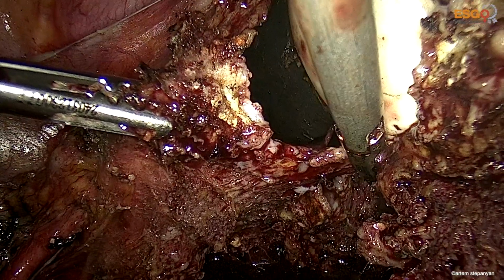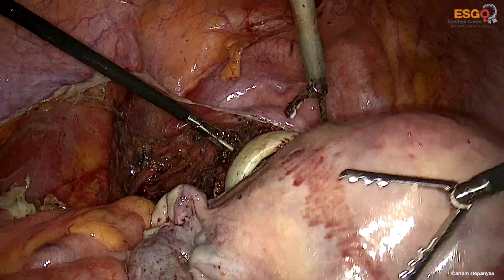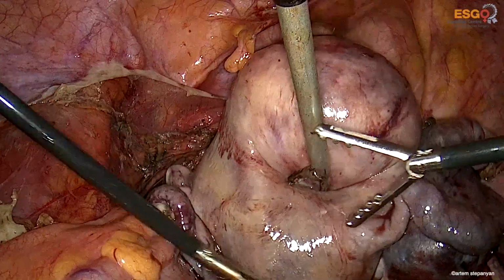And now we can retrieve the whole specimen in one block through the vaginal incision.